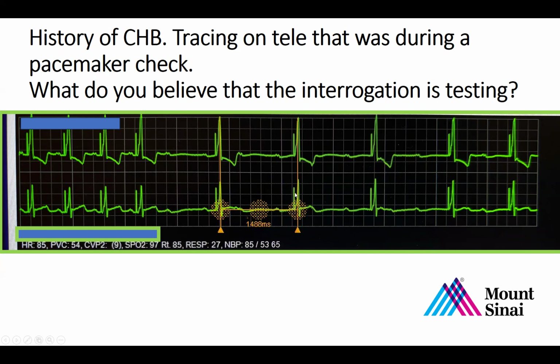And it turns out that at 40, the patient is still paced 100% of the time, which means that the escape rate is below 40. Presumably in a baby or a young person, the representative was not feeling comfortable going below this rate. And you will see, if you ever see any of my notes in the office or Barry's notes about checking thresholds, that if the escape rate is very low, we cannot test the sensing on the ventricular lead.